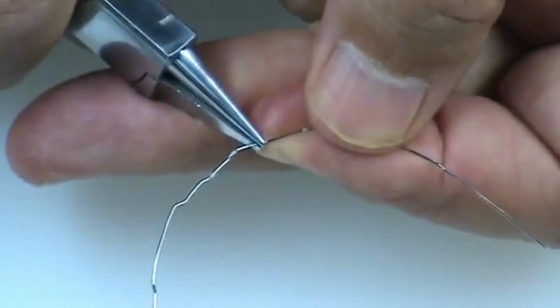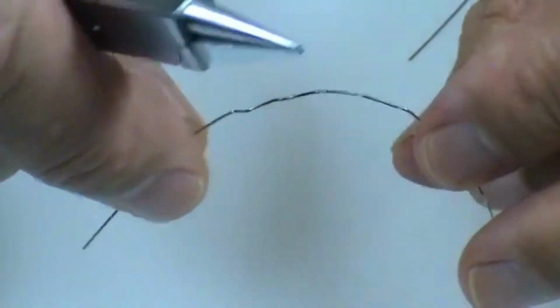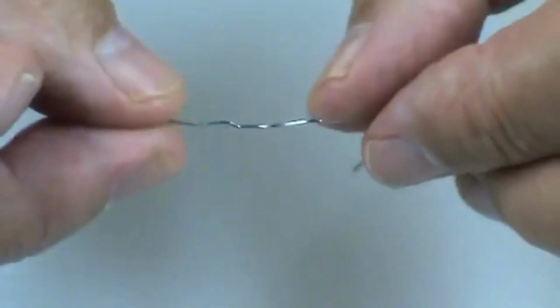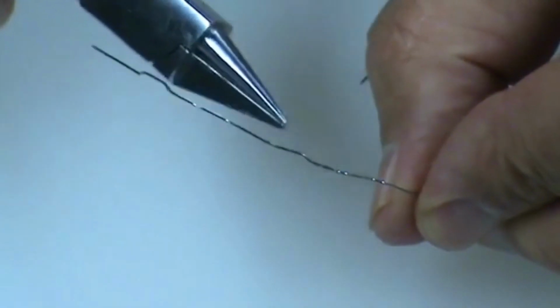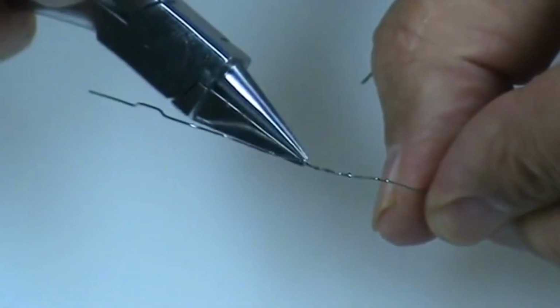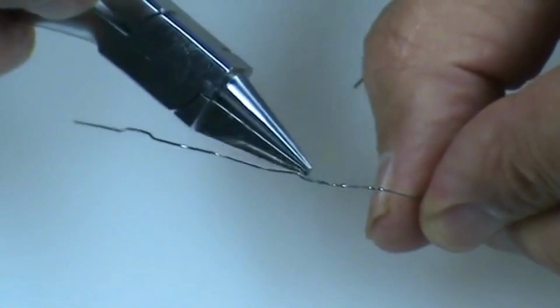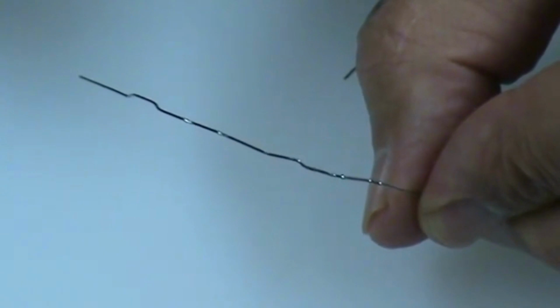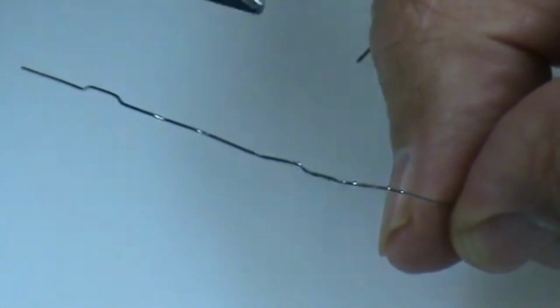So I just bent 3-1 up. There's a little dimple, and now the bend on 4-1 mesial looks bigger than it was in the beginning. 3-1 just has a little, it's like almost like a 1/4 millimeter step up, huh? And if you think it needs more, then you add to that.